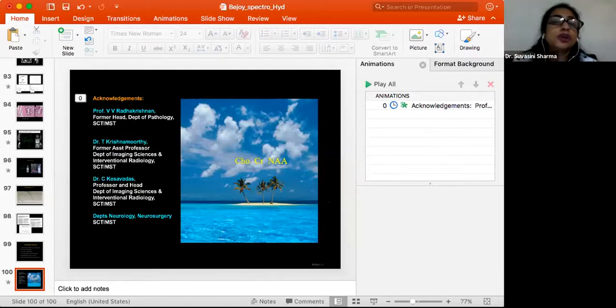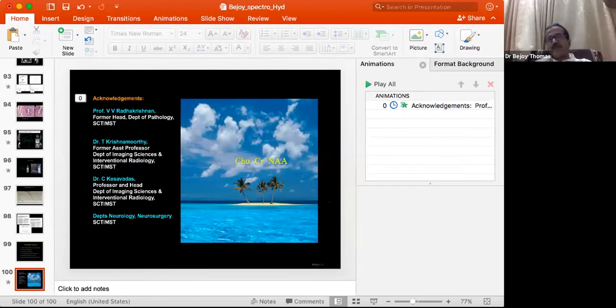So it's a question from Dr. Gauri. Why are there two creatine peaks? To be specific, I don't know, because creatine is phosphocreatine, creatine, and a mixture of all the things. In 1.5 Tesla at 3 ppm, you cannot differentiate between phosphocreatine and creatine.